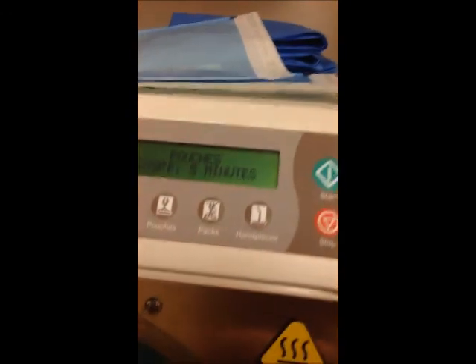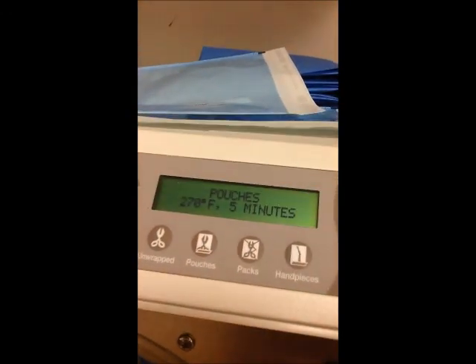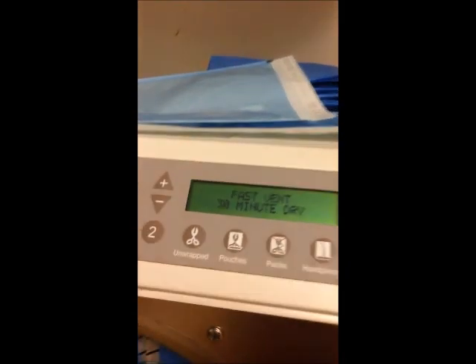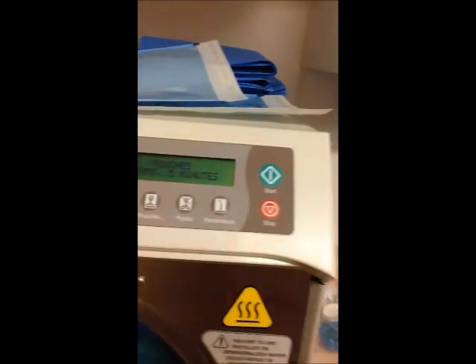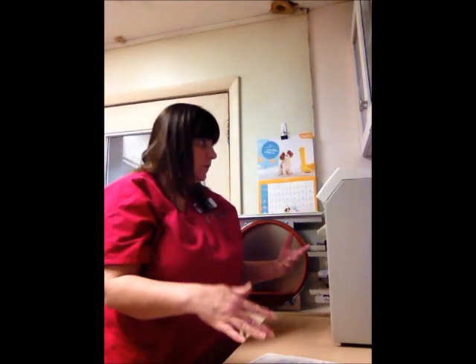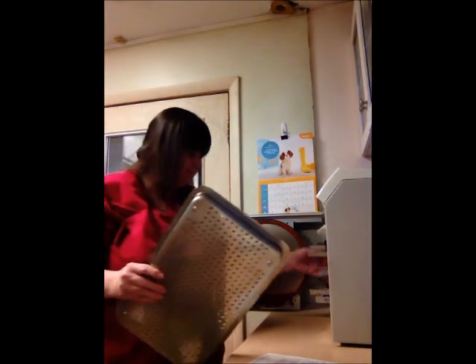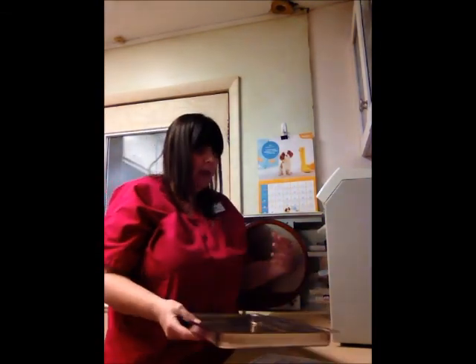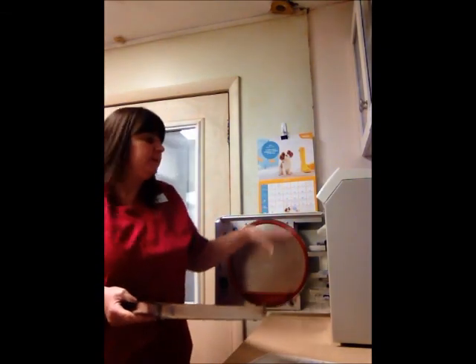You want the pressure in the autoclave to reach between 15 and 27 pounds per square inch. And the temperature range is exactly that. It's going to be between 250 and 270 degrees. Once a week, we wipe down everything in the autoclave. We take a damp cloth with some mild soap or detergent, and we will take all the trays out. We'll take these out as well, and we'll wash them, let them air dry, wipe down the whole autoclave.